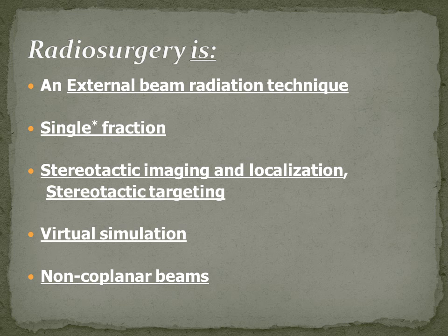So radiosurgery is an external beam radiation technique, single fraction. And while some people do use multi-fraction techniques, we at the university here have only done single fraction radiosurgery. Stereotactic imaging, localization, virtual simulation, and non-coplanar beams. And these are all keys that will be discussed later on in the week.